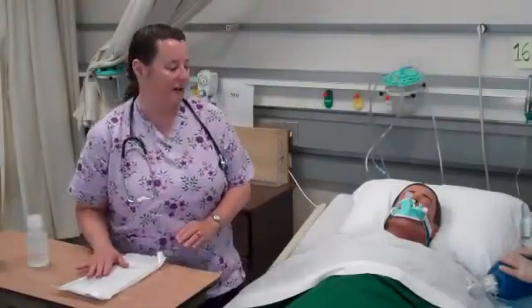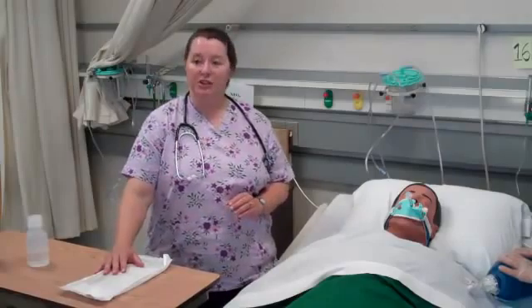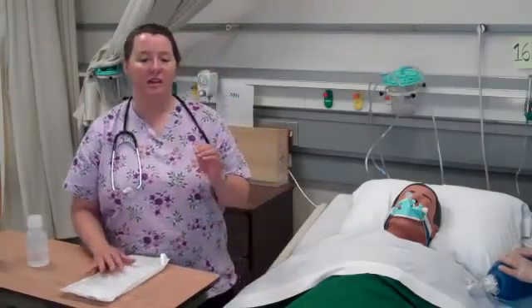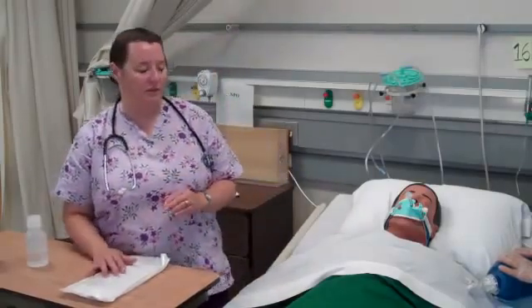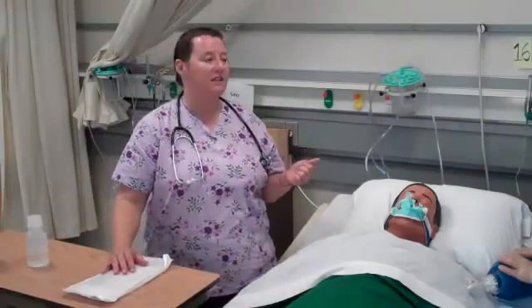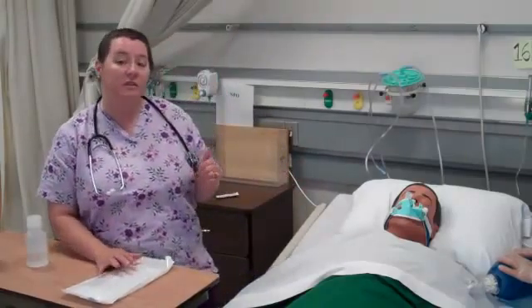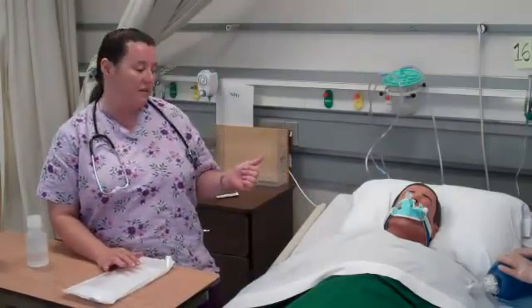We're going to be doing a demonstration on endotracheal suctioning. This is an invasive procedure, so we need to make sure that we have a doctor's order. Most times an endotracheal patient is in the ICU and you have standing orders available for intermittent suctioning if the patient's condition warrants it.